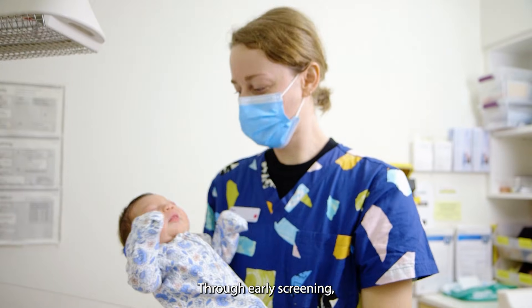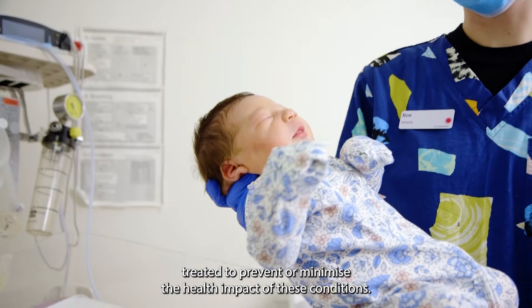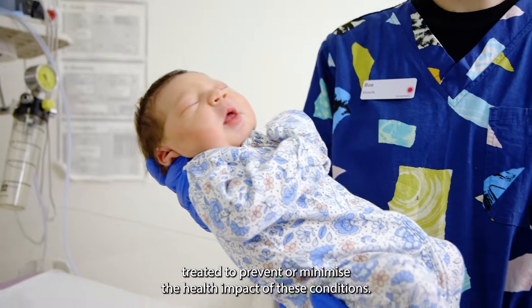Through early screening, affected babies can be identified and, in most cases, treated to prevent or minimize the health impact of these conditions.